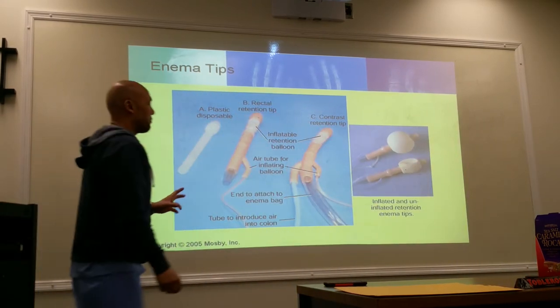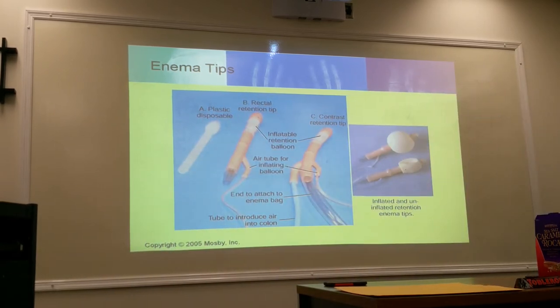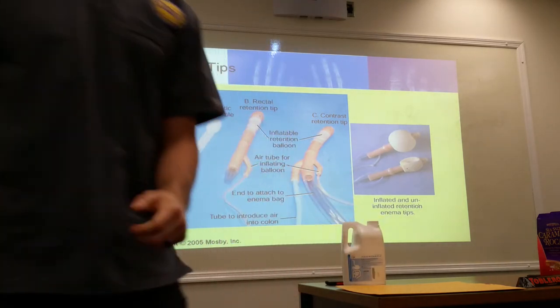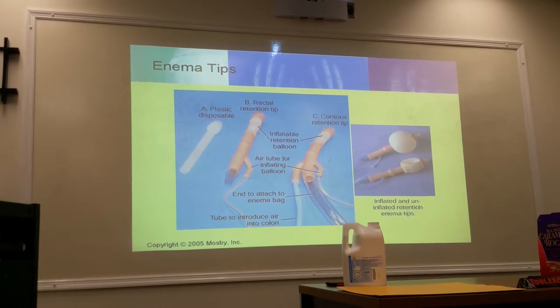Okay. Now, this cuff, the way this is made, it's intentional. The size of this cuff is intentional because you're only supposed to put in a certain amount of air into the retention balloon. The whole purpose of the retention balloon is to prevent the enema tip from getting dislodged, okay? You don't want to put any more than what's allowed in this cuff. That's the reason why, again, it's a certain size, okay?